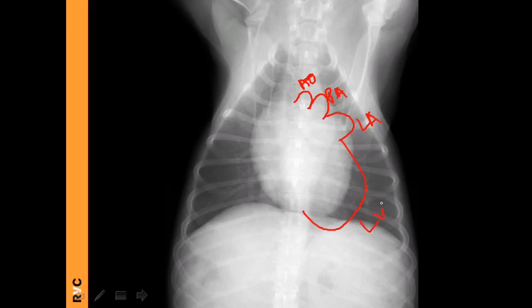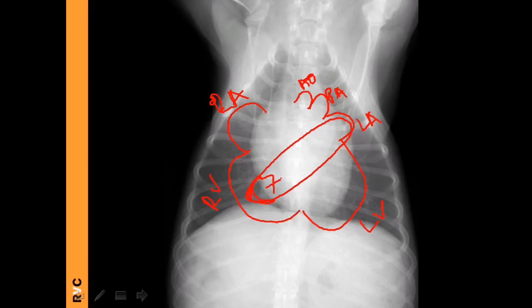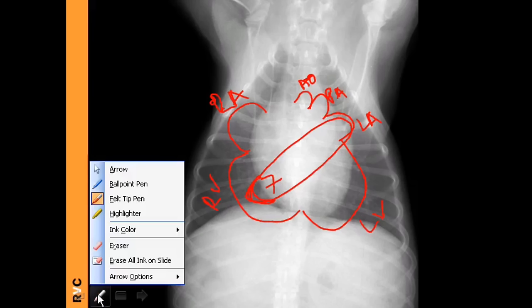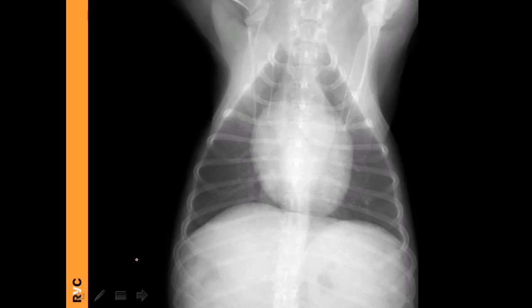For the cardiac silhouette on the VD view, we use the clock approach: 12 to 1 o'clock — aorta; 1 to 2 — pulmonary artery; 2 to 3 — left atrium; 3 to 6 — left ventricle; 6 to 9 — right ventricle; 9 to 11 — right atrium. Where we see a bulge, we assume that is the enlarged chamber. Bear in mind the left atrium sits more caudally, so if extremely large, you'll see a bulge around 7 o'clock. Radiography is not the most sensitive for cardiac evaluation; echocardiography remains the gold standard today. Also watch out for scapular superimposition causing increased opacity in the cranial lung lobes on the VD view.